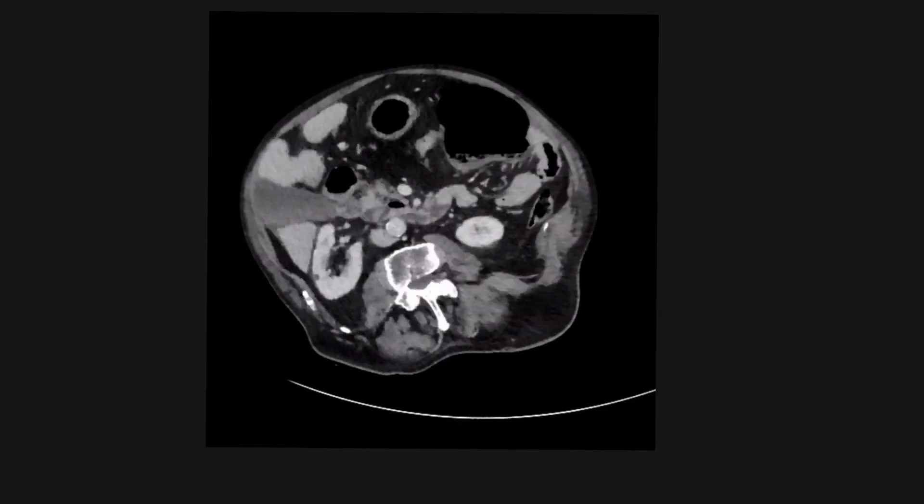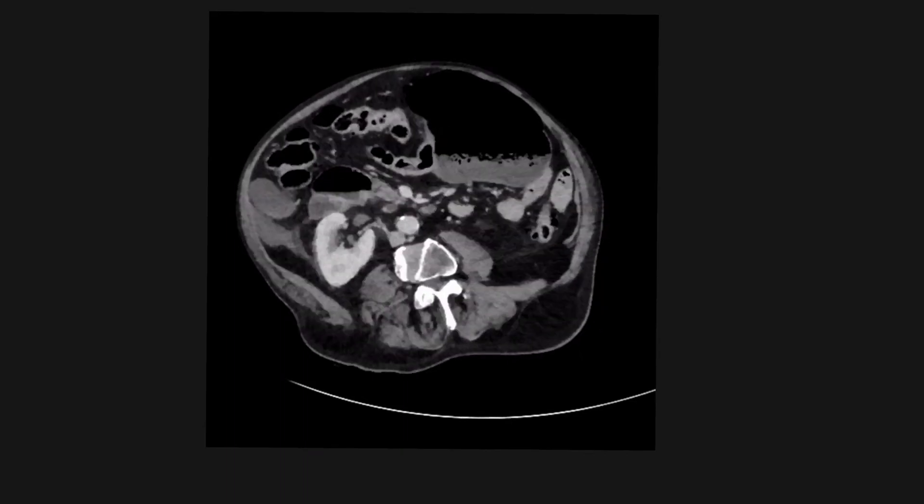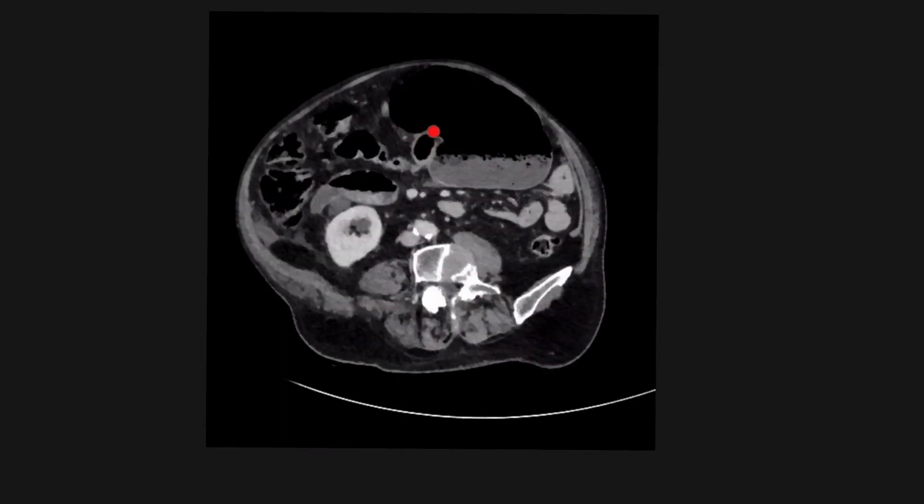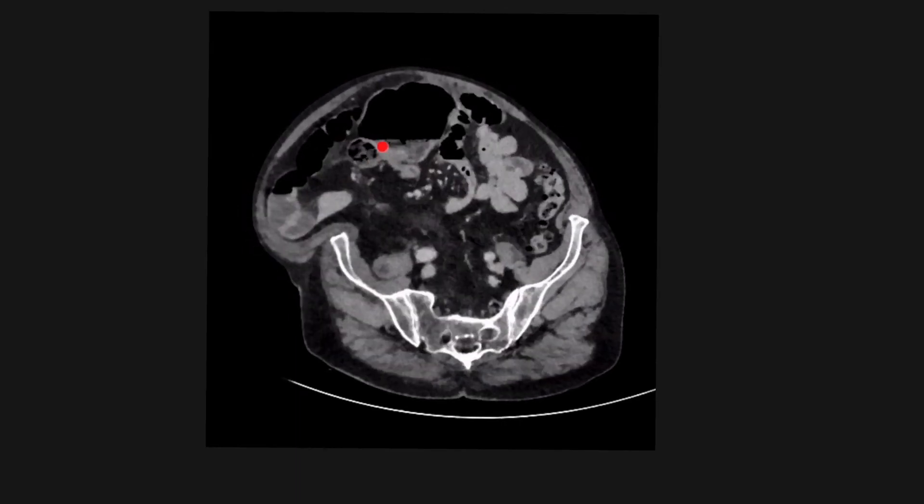We'll just check out the CT to confirm our suspicion. Here we can see a dilated cecum, and the laser here is pointing to the ileocecal valve, and what we saw on the x-ray was the terminal ileum.